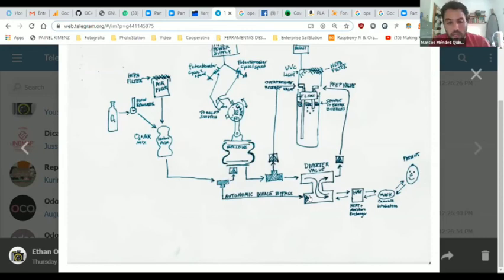So for example, if the bellow system is trying to fill up with air, it won't be pumping air to the patient. But if the patient wants to breathe in, he has to be able to breathe in. So in this case, these check valves open and we provide oxygen mixture from the O2 tank, but it's regulated. On cycle 2, the bellow system pushes air through this T, and this valve closes here, and it diverts the air to the patient.